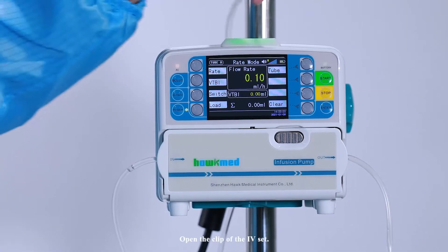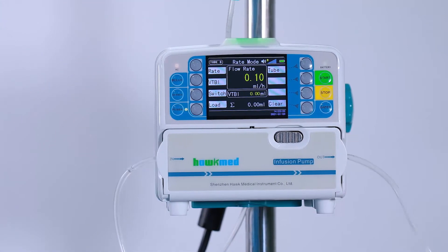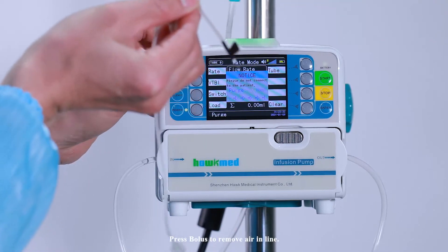Open the clip of the IV set. Press bolus to remove air in the line.